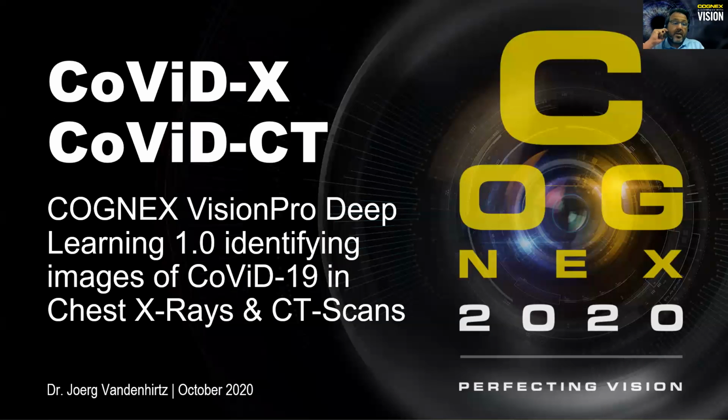Hello, everybody, and thank you very much for joining my short summary on the usage of COGNEX VisionPro Deep Learning for the identification of COVID-19 images on chest X-rays and CT scans.